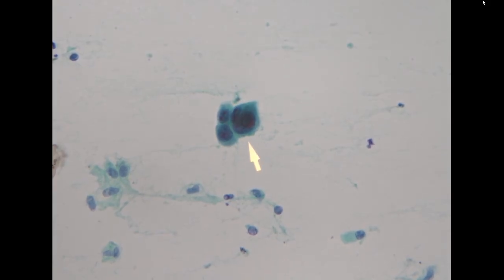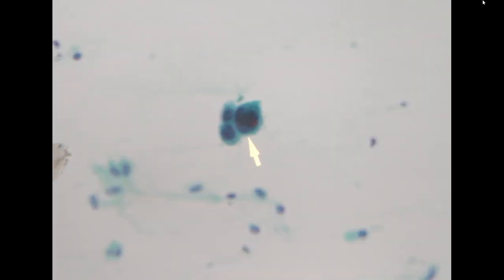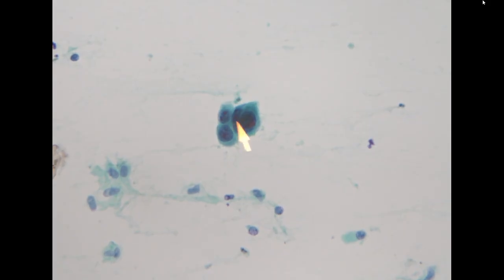So this is a pancreatic adenocarcinoma. You can definitely see what we call the 1 to 4 rule, which is a variation of the size of the nuclei of 4 times or larger. So this is 4 times larger than these cells, and this is definitely malignant.